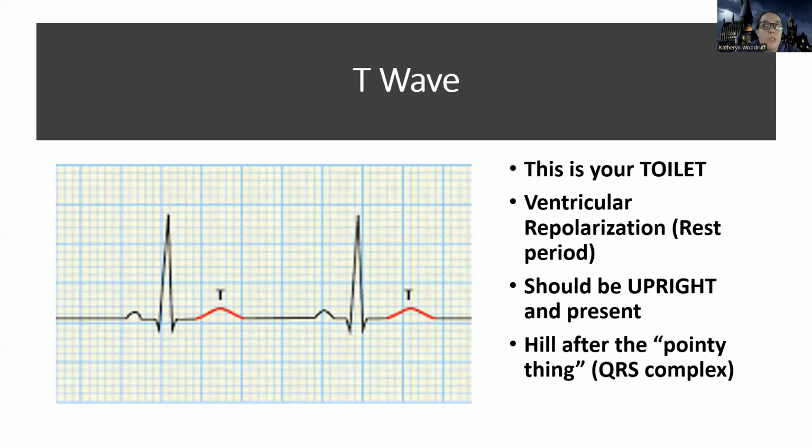And if you don't flush your toilet twice, then I'm sorry if that analogy doesn't help you, and good luck to you. But sometimes we need to flush twice. The other things to know about the T wave is it should be upright and present. So you should always have a T wave, unless you have some really, really deadly rhythms. It should always be upright.